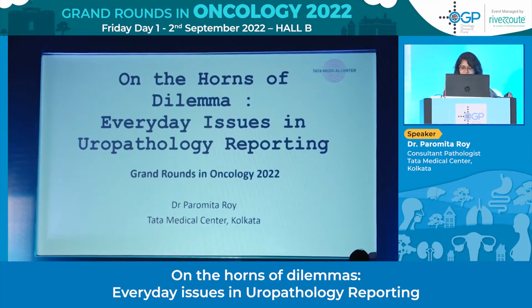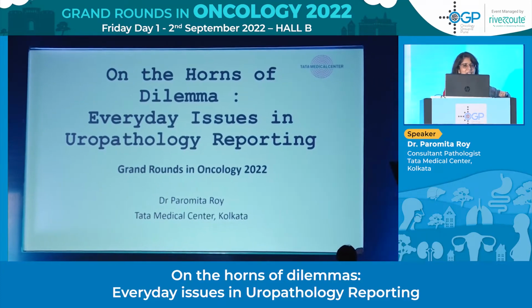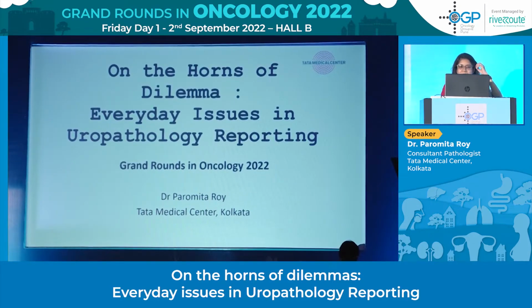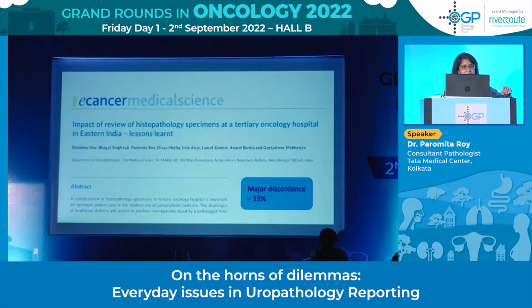I've been really enjoying the sessions since morning, and I'm going to share over the next half an hour a few simple cases which we have encountered in uropathology, which we have struggled with, and hopefully my mistakes and my difficulties will help people in the audience.